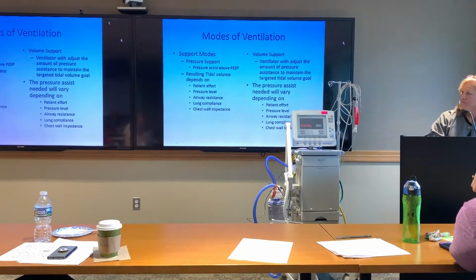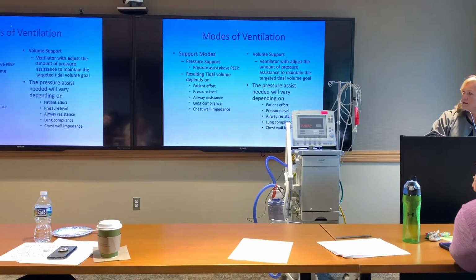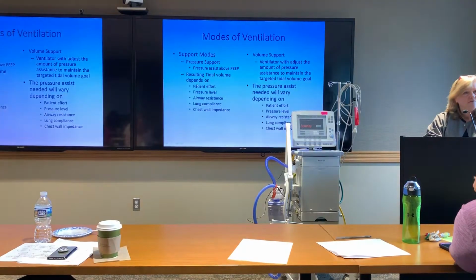Pressure support. The patient has to be breathing, has to have an intact drive to breathe. If he does not initiate the breath, nothing happens until the apnea phase kicks in, and we'll talk about that a little bit later. But how do I know what tidal volume I'm going to get? So I set a pressure level, and if the patient takes a breath, he gets breath support up to that pressure level, and then it kind of tapers down.